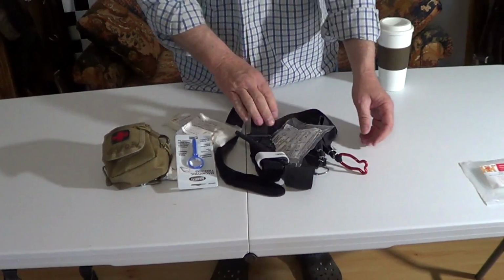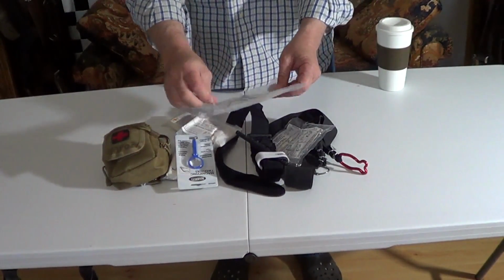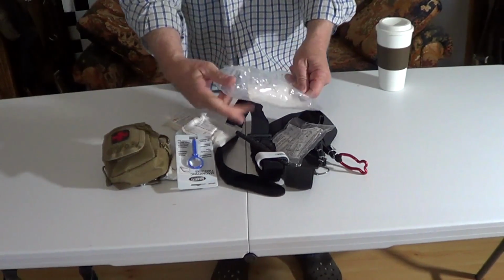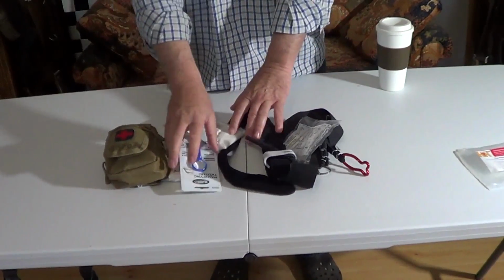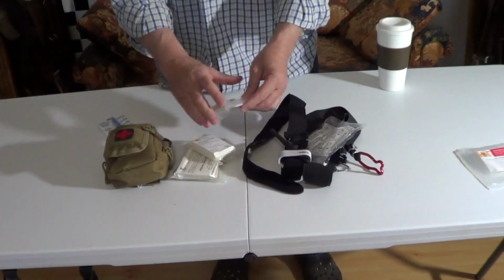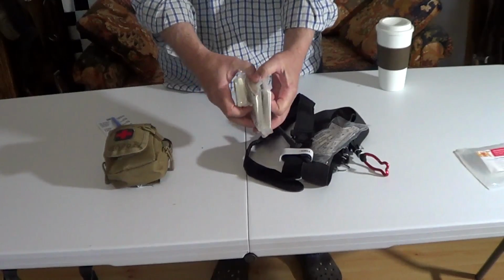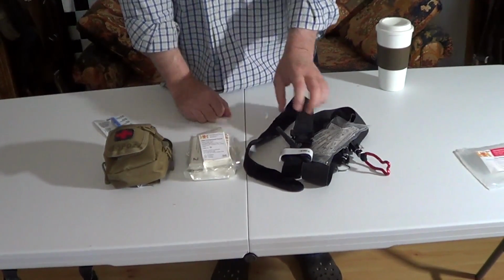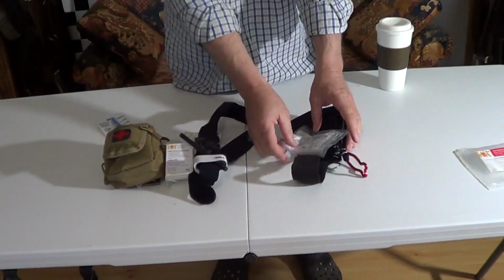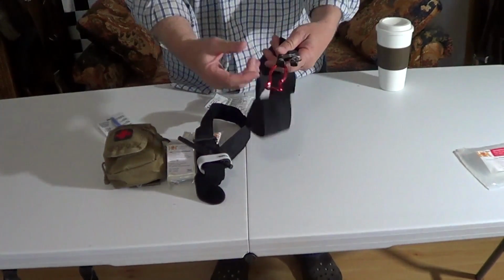Other than that, here's the pouch where it was all sealed and tough to get into. I went ahead and cut it. It was nicely packaged, but I didn't want to be doing that if I needed it in a crisis. So I'm going to leave these packaged because they have easy pull tabs that open, and it keeps them sterile. But I'm going to put in a decent tourniquet. I don't know what the hell I'm going to do with this.